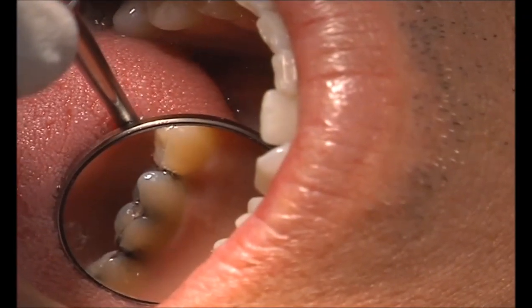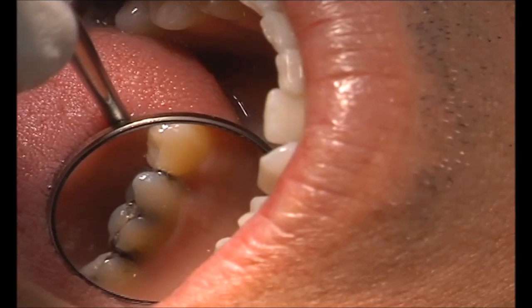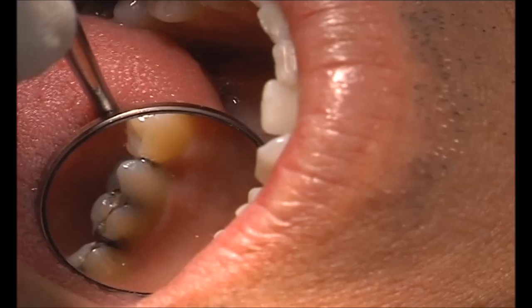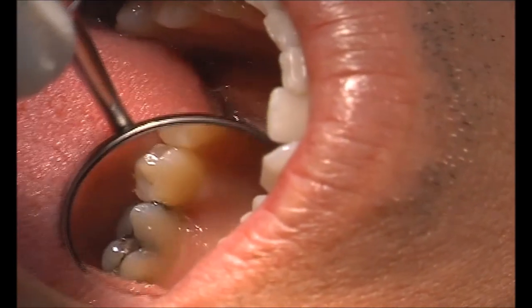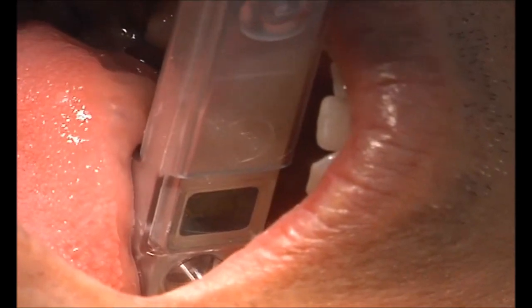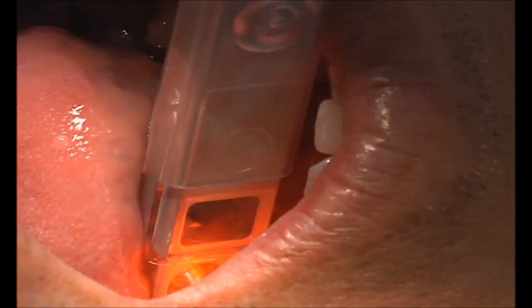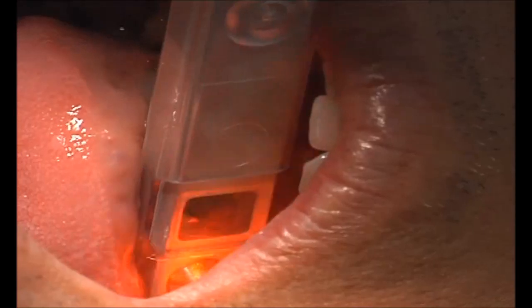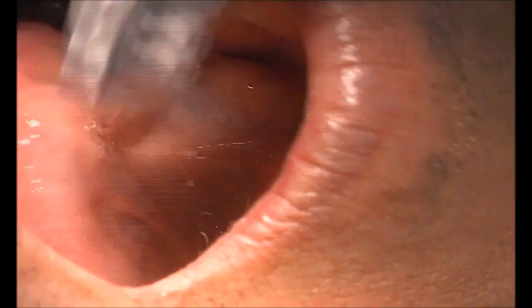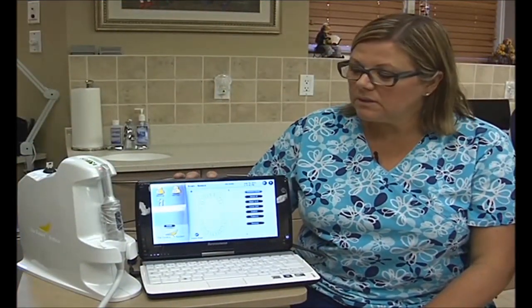As you can see on the 4-6 lingual, there is some gray shadowing down the lingual ridge. I'm going to scan that area just to see if that is actually some amalgam tattooing or decay. I just want to be perpendicular to that area. So we know being over 20, there is something going on around that tooth.